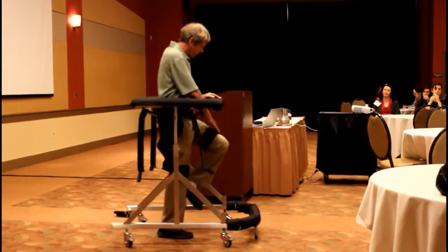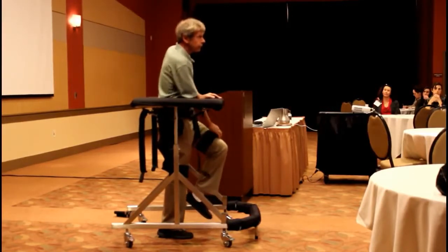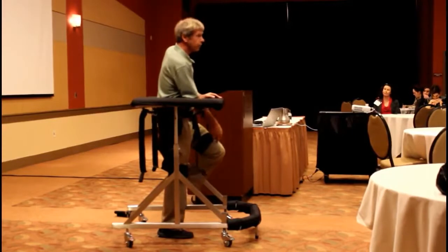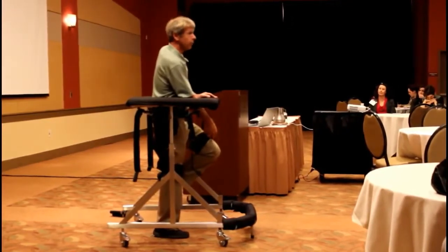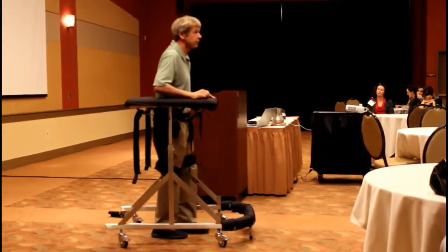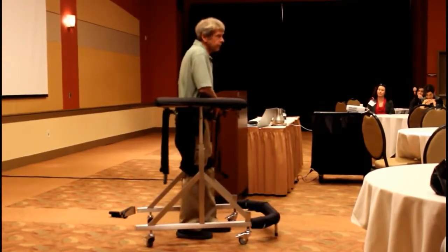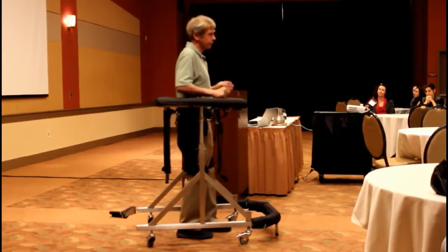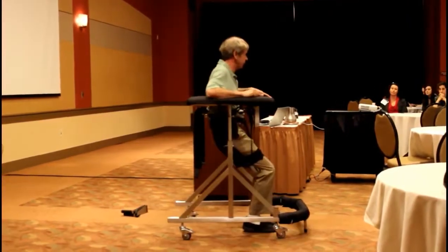And the same with if you want to do resistive types of things, there are cuffs that have little plastic rings. So if I want to use Thera-Band tubing or something and actually work on a leg, I can do that as well. So you can get as creative as you want as a therapist, but your hands are free to work on someone and not have to concentrate on holding the frame.